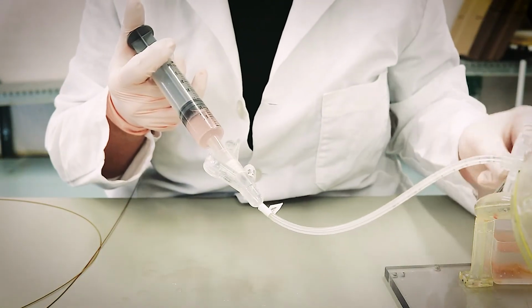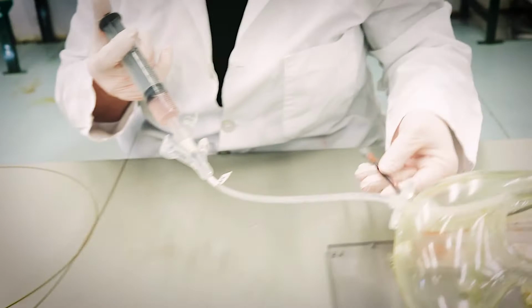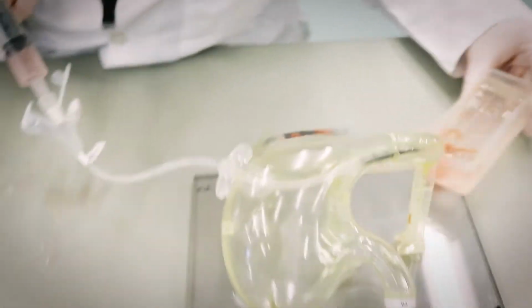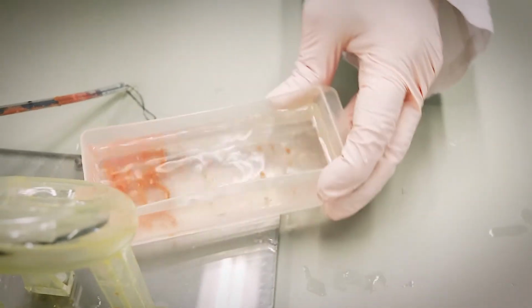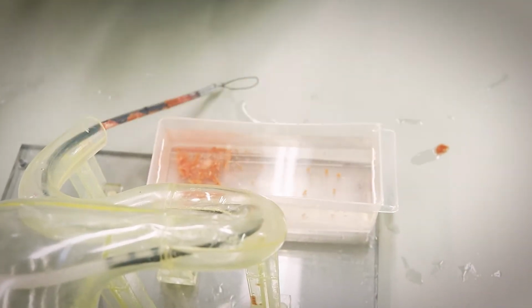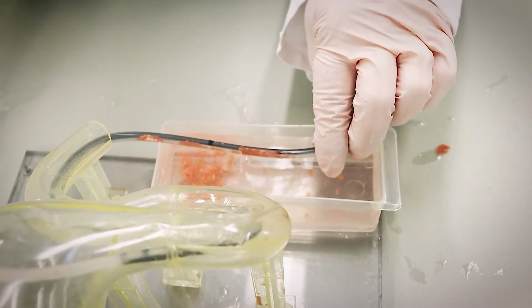So what happened was, as I held that pressure, all of the stuff in this tube was slowly moving and squirted out these ports. All of it just slowly came out while I held that pressure on there from me loosening it up. With the clearing stem, what I did was put a trail inside that clog material that allowed the water to get inside of it, and therefore it wasn't just like a solid rock anymore.